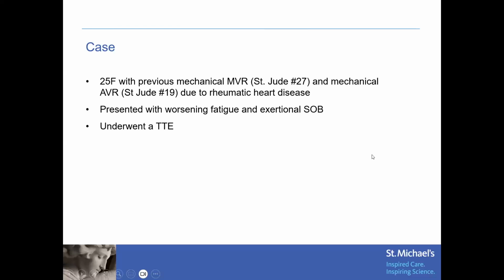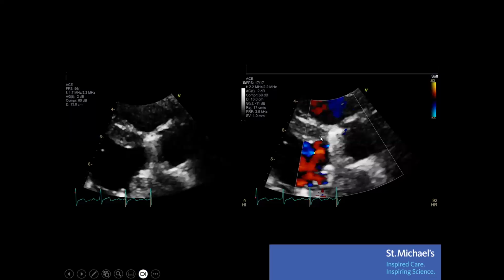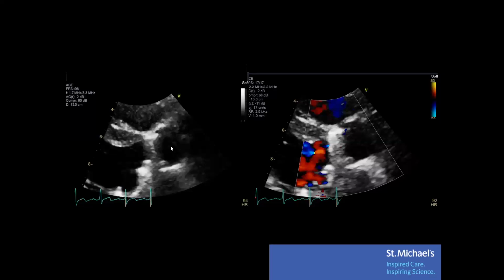Yesterday we had a visitor from Siemens, and we thought that in about 2 years from now, you don't have to do measurements anymore. So that's one of the thoughts. But if you do go to the meetings, every single company, GE, Philips, Siemens, they all have onboard automated measurements. The question is how accurate it is and what it allows us to do, remeasurements, and if we have to.